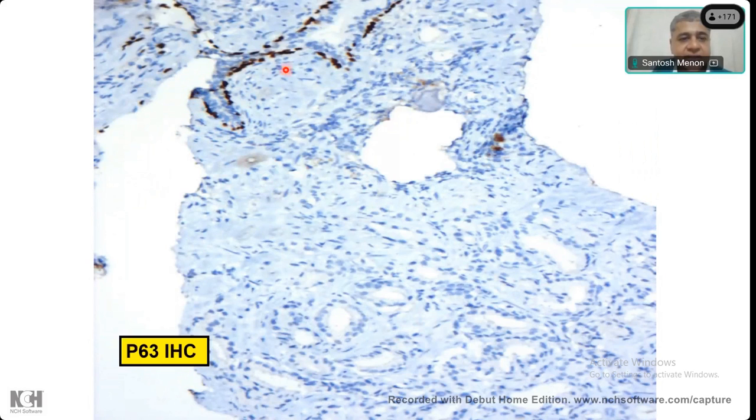Yes. So Shivani, can you tell me where is the cancer in this? Is this the cancer or is this the cancer? The lower one? You agree? So these are your glands, which are very small, with rigid lumens. They look very suspicious on morphology if you had an H&E. And then you do a P63 or a P40, which is a basal marker, to show the absence of basal marker in the suspicious focus.